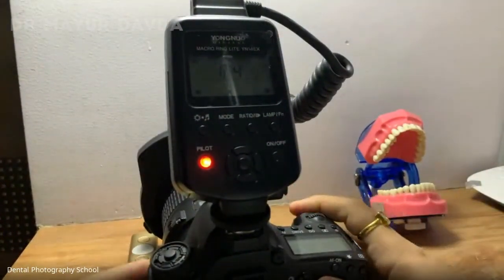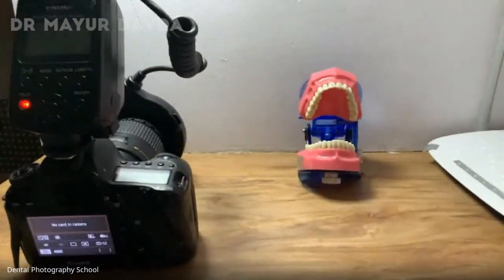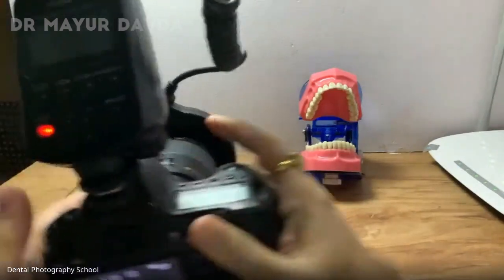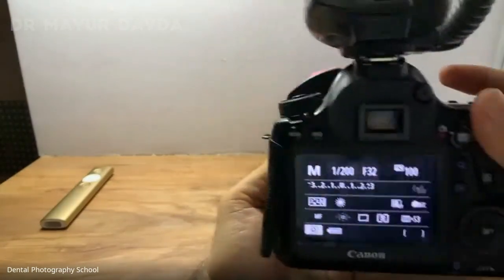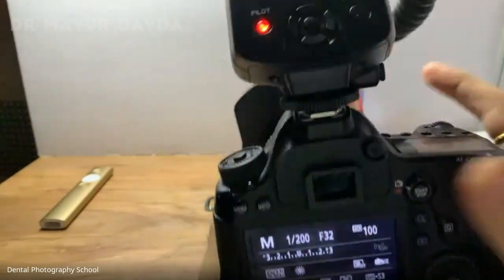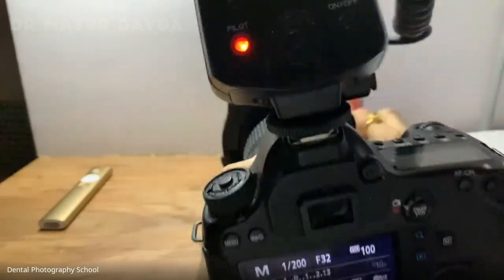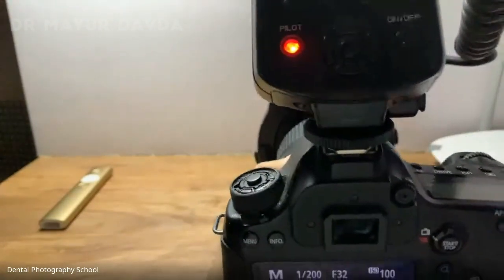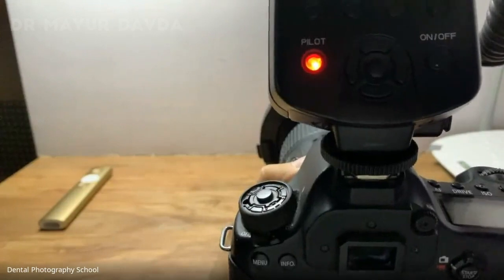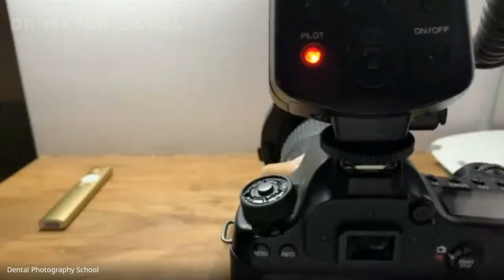Okay, so what I'm going to do is show you all what is going to happen. Everything is set: MR is set, flash power is set, camera settings are set. What most people do is try to take a picture on autofocus of the lens, and this is where they go wrong. Whenever you are using autofocus, the camera is never going to focus because it's really difficult for the camera to focus.